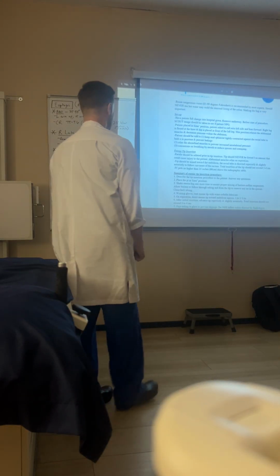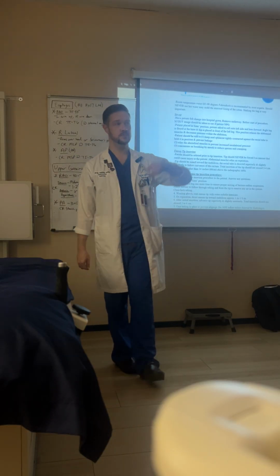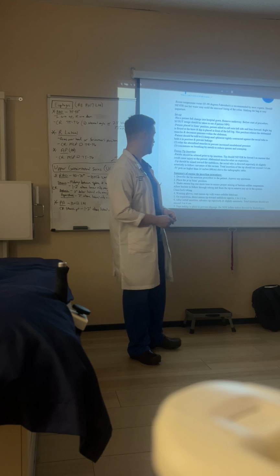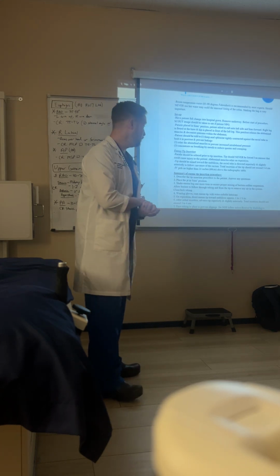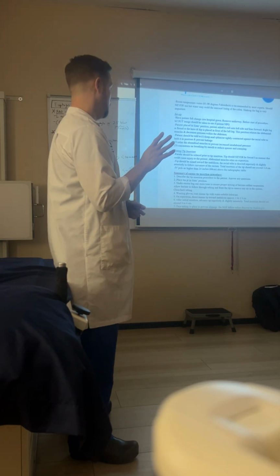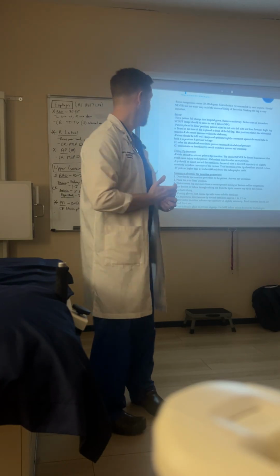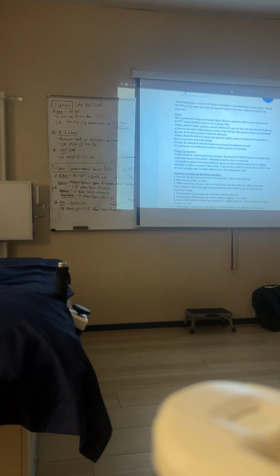Yes. Okay. The tip should be aimed toward the umbilicus, okay? So you're going to basically go like that, okay? The rectal tube is directed superiorly and slightly anteriorly to follow the curve of the rectum. And the total insertion of the tip should not exceed 3 to 4 centimeters, so about 2 inches, okay? 1.5 inches, 2 inches. The IV pole, again, should be no higher than 24 inches above the tabletop, okay? Questions on any of that?